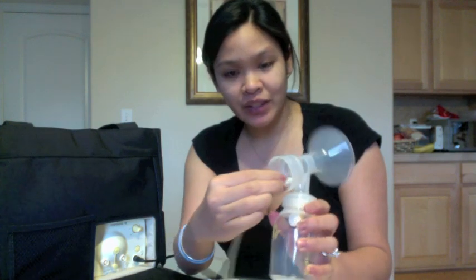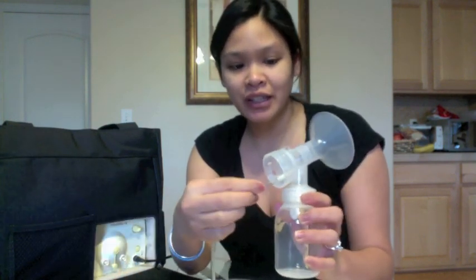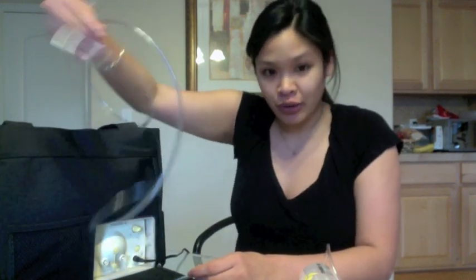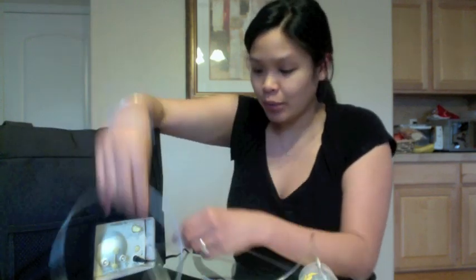As far as your valve goes, this end, the end that has that yellow piece on it, connects into this little hole right behind the pump, like that. It's not going to snap or anything, it just goes in really easily. The side that doesn't have anything is going to connect to the pump right here. And so there are 2 different holes right here.